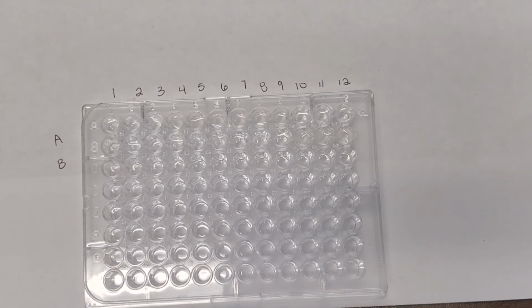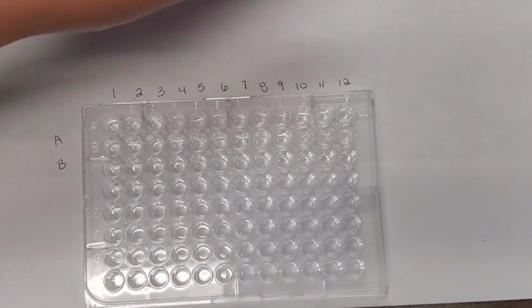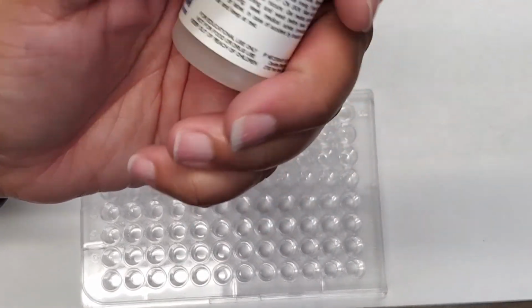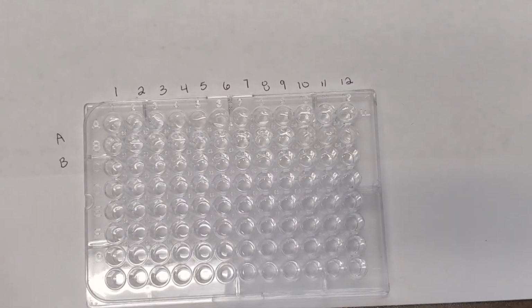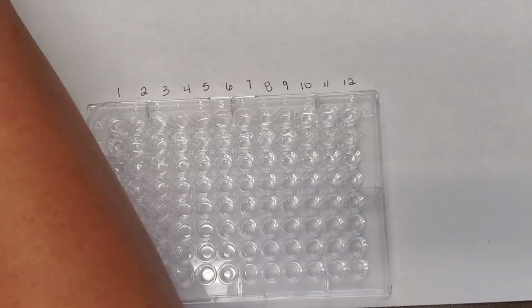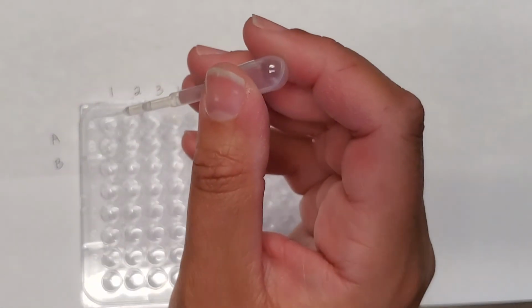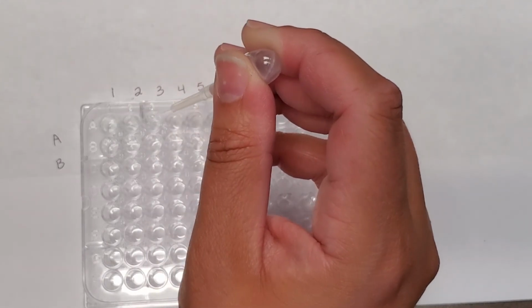And then the very last step is adding chromogen. So chromogen is going to be the thing that actually goes through and does a color change. So that simulated chromogen, what it's going to do is if that secondary antibody, which we just added, binds to the antibody that may be present in the patient's serum, this chromogen is going to facilitate a color change.